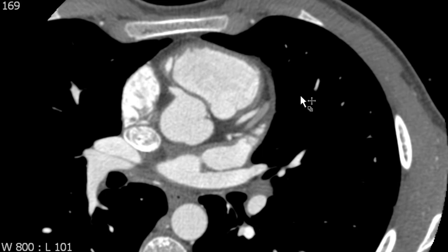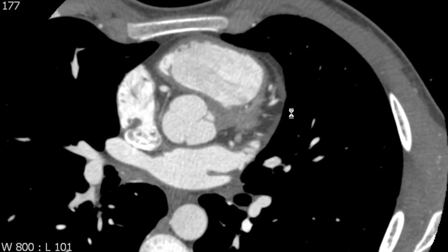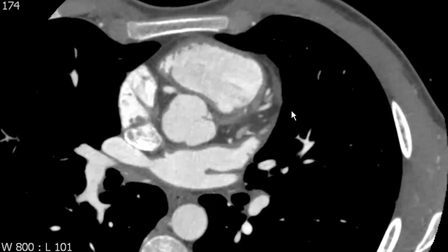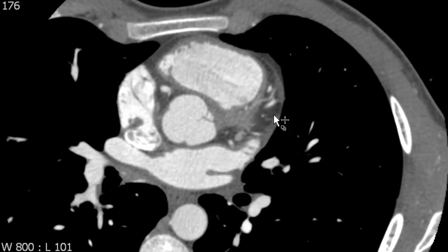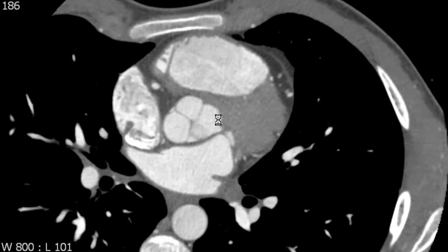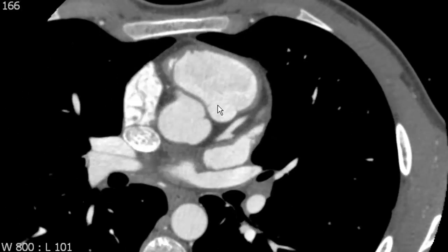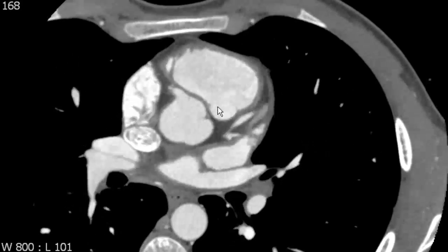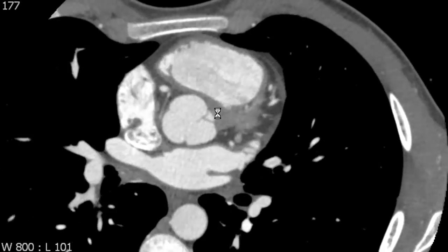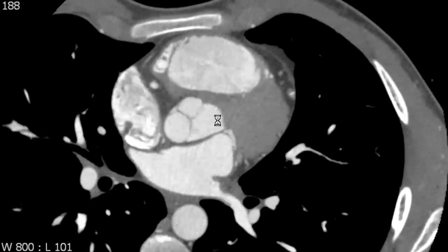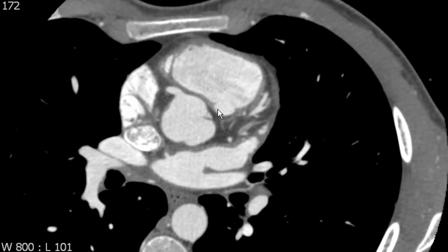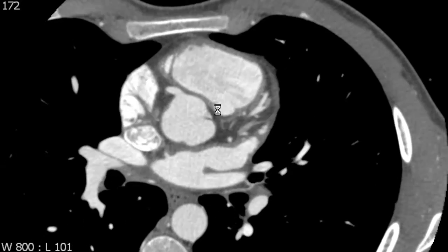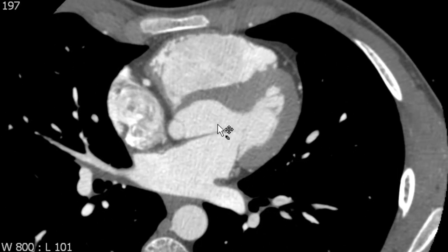Now we're going to look at the aortic root. On axial imaging we can see that the aortic root is oblique to the axial plane of the body. As a result you're never going to really get that nice Mercedes-Benz sign of the tricuspid aortic valve on axial imaging — it's best to look at that on a double oblique image. But for the purpose of our source imaging we want to be very familiar with the structures of the aortic root on axial imaging.